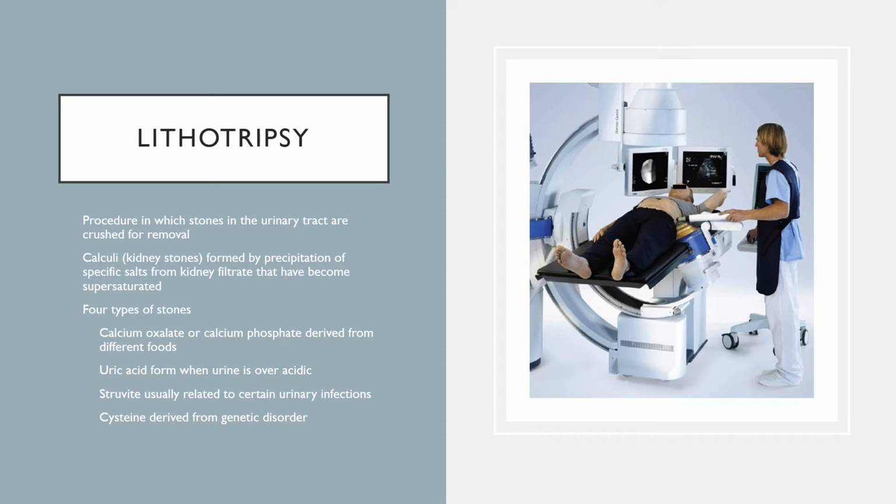And then finally, we can use a holmium YAG laser, which we have seen in the past, if you remember back when we watched the cysto video. They fed the laser up into the ureter, broke that stone apart, and then again we use a basket or grasper to bring out those pieces of stone.